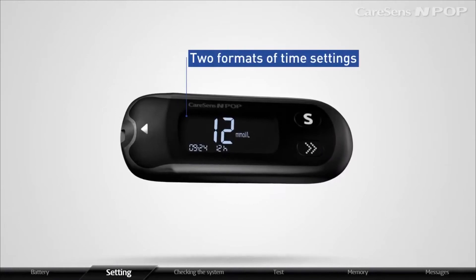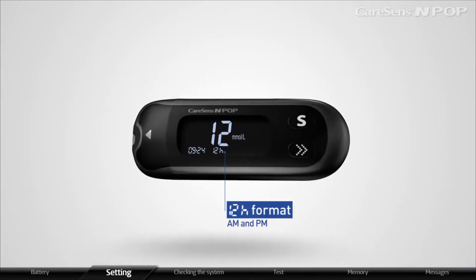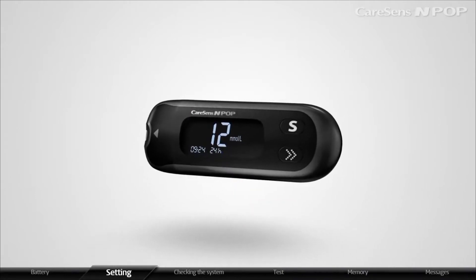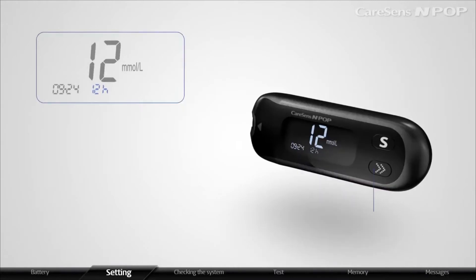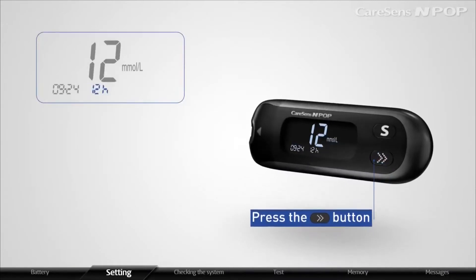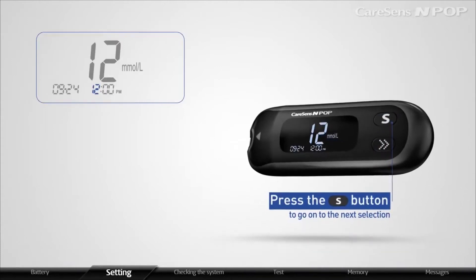CareSense InPop provides two formats of time settings: 12-hour format with AM and PM, and 24-hour format. Press the arrow button to choose 12-hour format or 24-hour format. After setting the time format, press the S button to go on to the next selection.